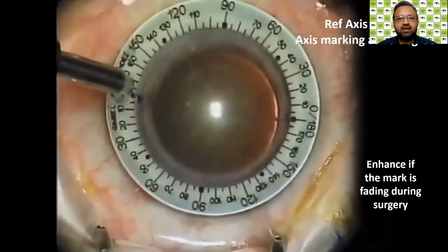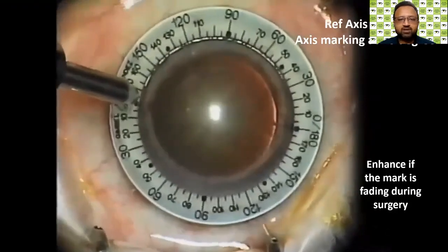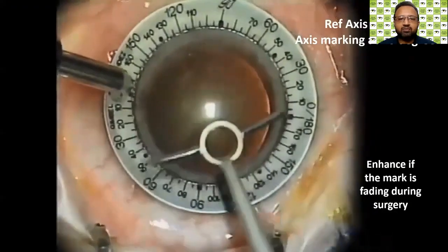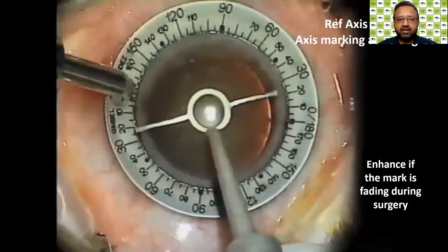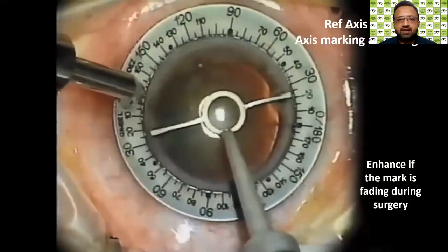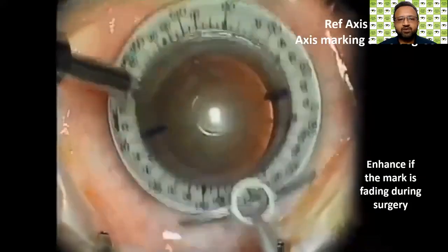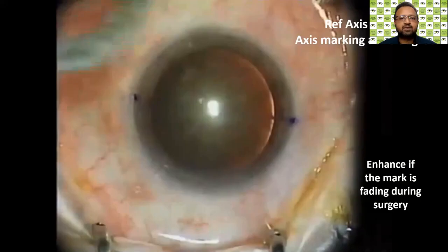This is the axis marking: the reference marking was at 180 degrees, and 20 degrees was my axis marking, and we place it sharply there with the ink. We always need to remember that if there is any chance it fades, we need to enhance it during the surgery. We never compromise with this axis marking.